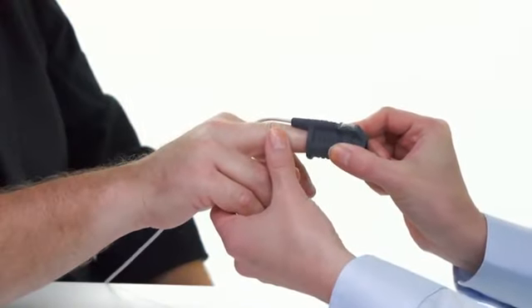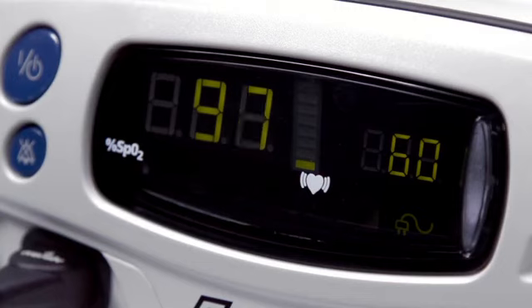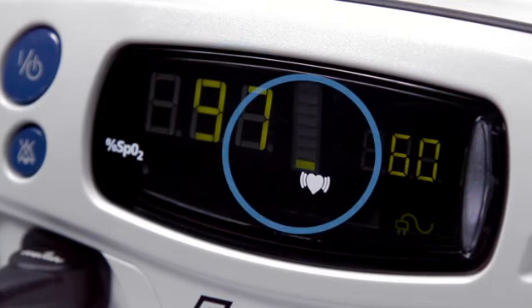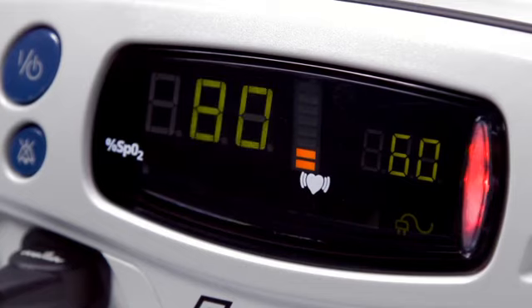After the startup sequence, the oximeter will start displaying and recording SpO2 and pulse as soon as the sensor is placed on the patient. The SpO2 level is shown on the left side and the pulse rate on the right side. The pulse strength signal bar in the center indicates the signal quality. Green bars indicate a strong pulse signal, amber indicates a marginal pulse signal, and red indicates a low pulse signal.